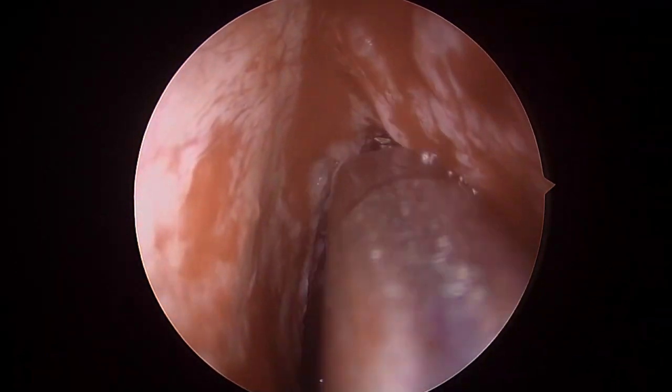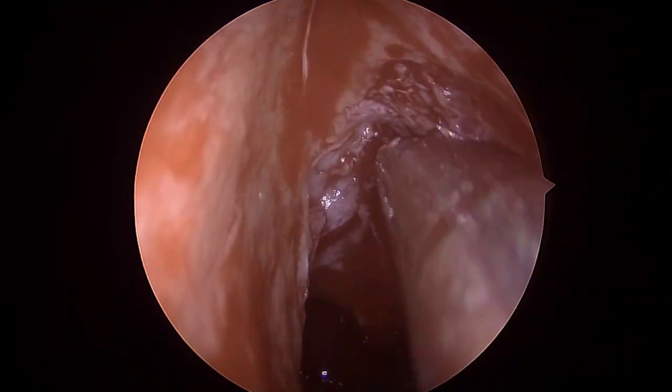So this is how you define the middle turbinate and get landmarks for FESS surgery.